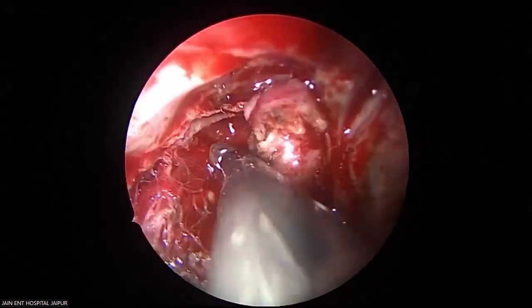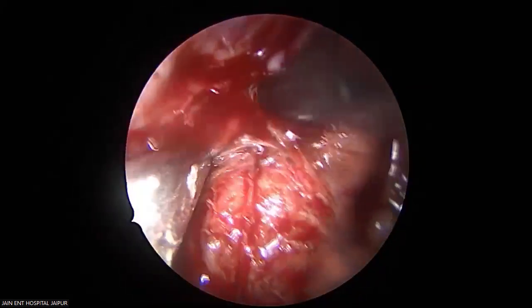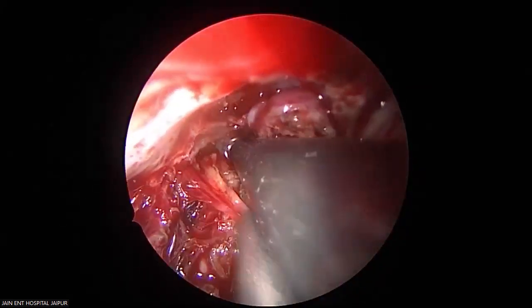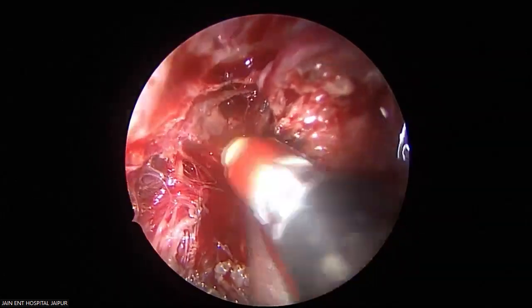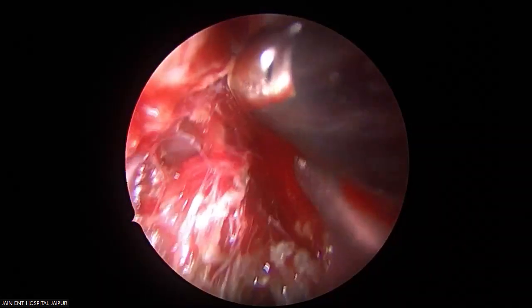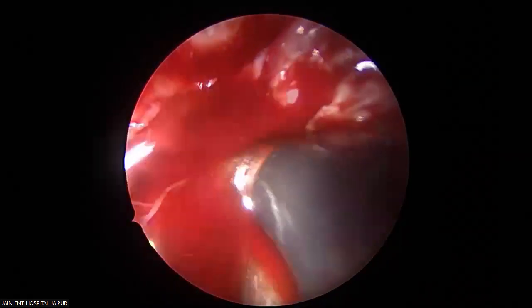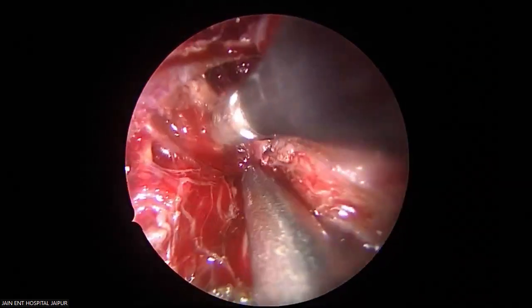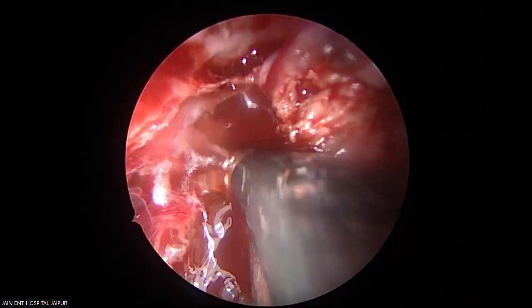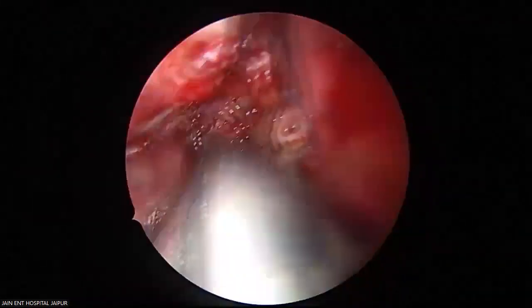With such a massive tumor, identification of the vessel is always a challenge. You need a great exposure for that. I will show you exactly.